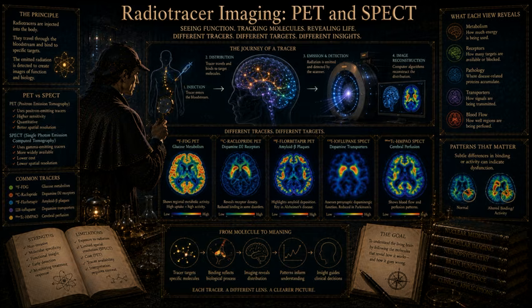Okay, so we inject this microscopic fleet of GPS-tagged vans. The tags themselves are the radioactive isotopes. Let's talk about the engines powering these tags, starting with PET, positron emission tomography. The big one. I brought up antimatter earlier, and I want to really dig into this because the physics happening inside a patient's head during a PET scan is genuinely staggering. It is one of the most beautiful applications of quantum mechanics in medicine.